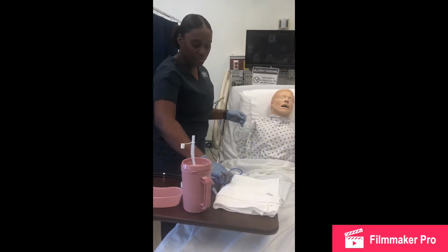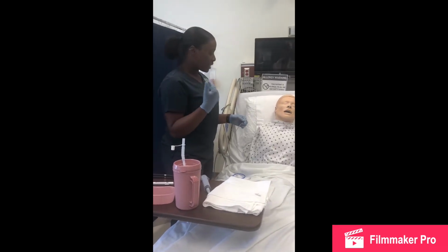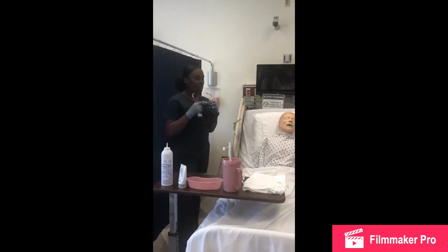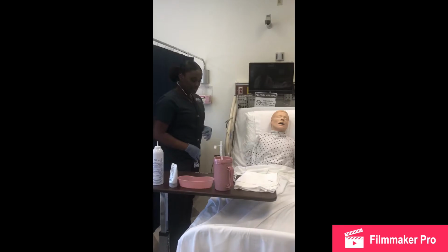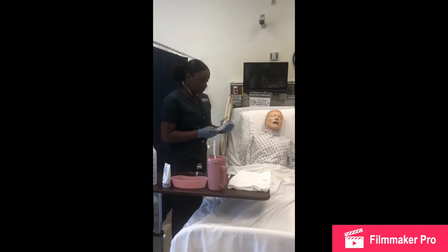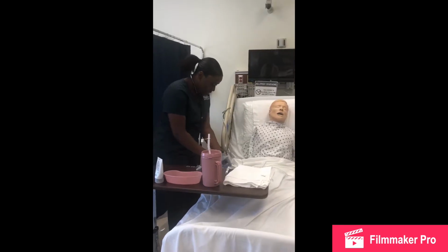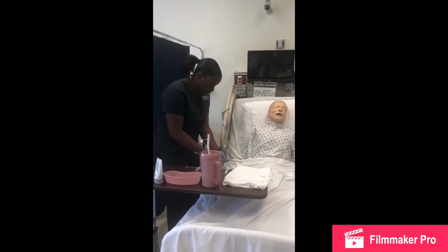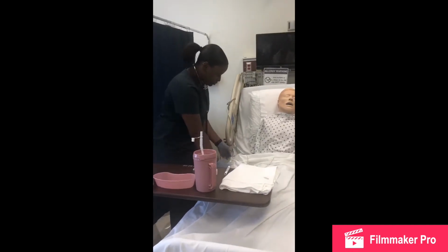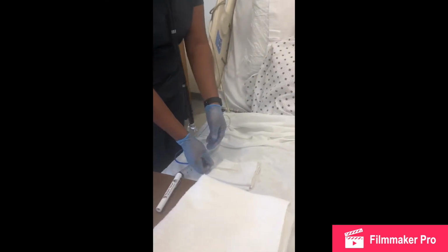I'll make sure I have my pen light in reach so that I can check to make sure that the cord doesn't coil at the back of the patient's mouth. Now I'm going to get my stethoscope and put it on my neck to have it ready. I'm going to have my syringe ready, pull up 30 cc's of air, and attach it to the end of my NG tube. Lubricate the tip of the NG tube well.